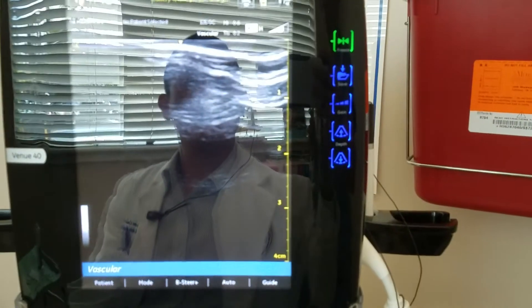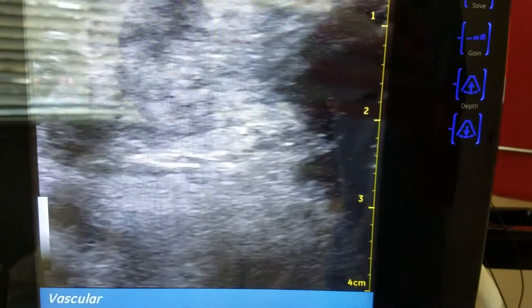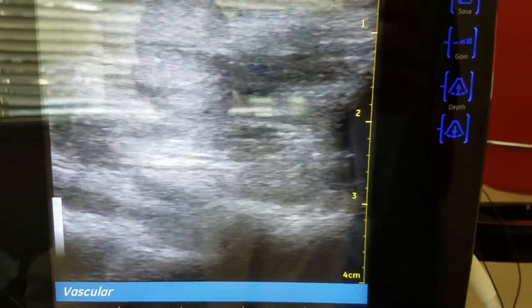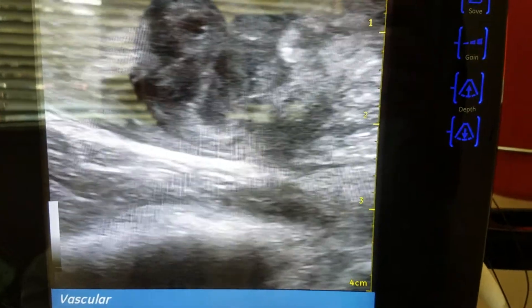We're dealing with an Achilles tendon rupture about one and a half months out. This is the ultrasound — we have the MRI to confirm it. You can see the nice hematoma right here. The Achilles tendon distally and proximally: this is towards the heel, that is toward the upper leg or the knee. I find the gap right here — it's a two centimeter gap on the MRI, 1.9, so about two centimeters.